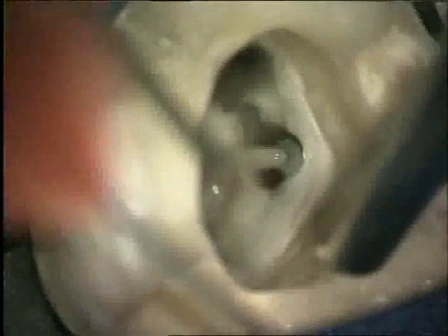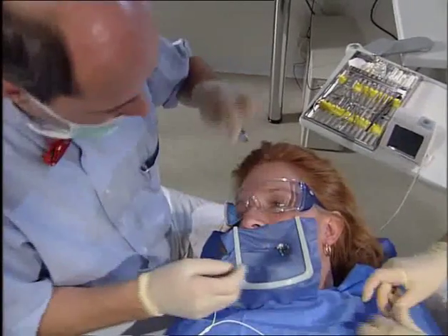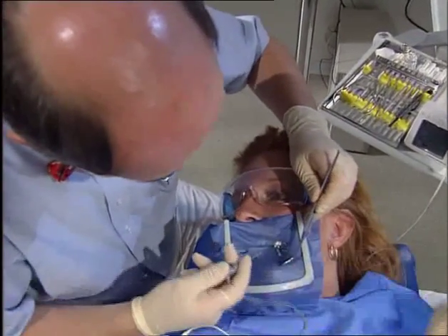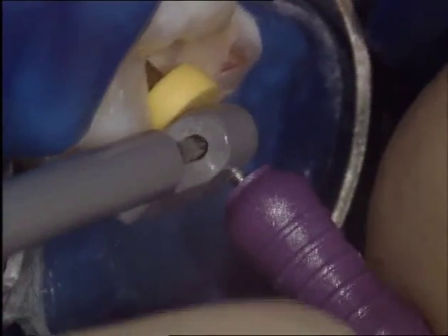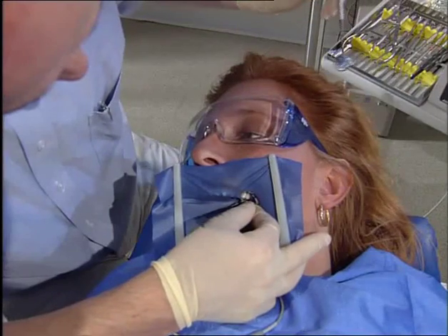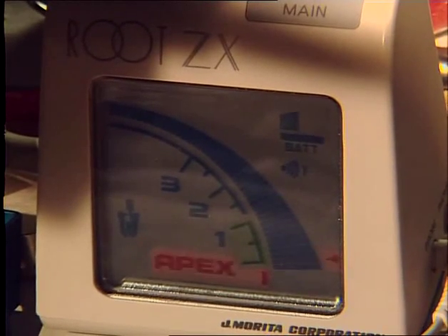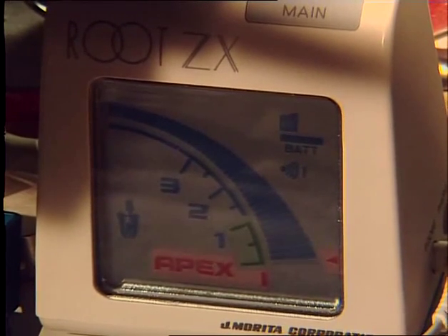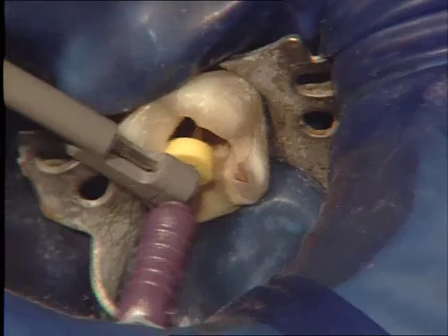The access cavity is gently irrigated with sodium hypochlorite. In order to avoid over-instrumentation, the length of the root canal instruments must be checked carefully. Modern apex locators measure the electrical impedance between the file and the mucosa. These devices provide accurate measurements to within 0.5 millimeters of the apex. The position of the root canal instrument is displayed on a screen, as well as acoustically.